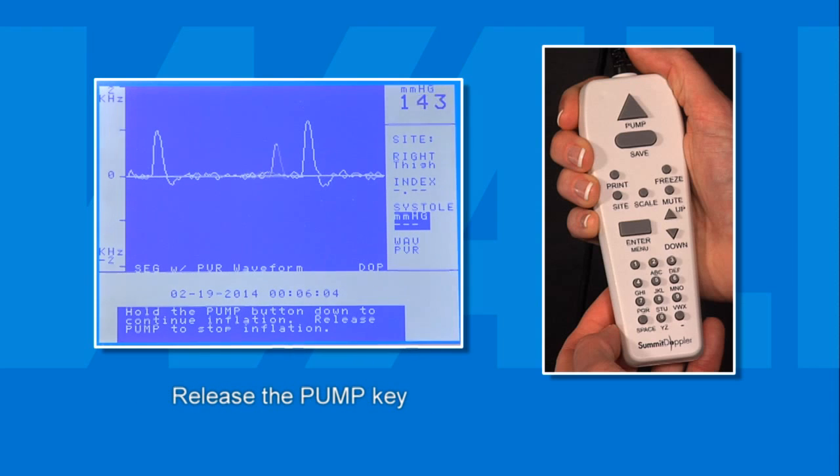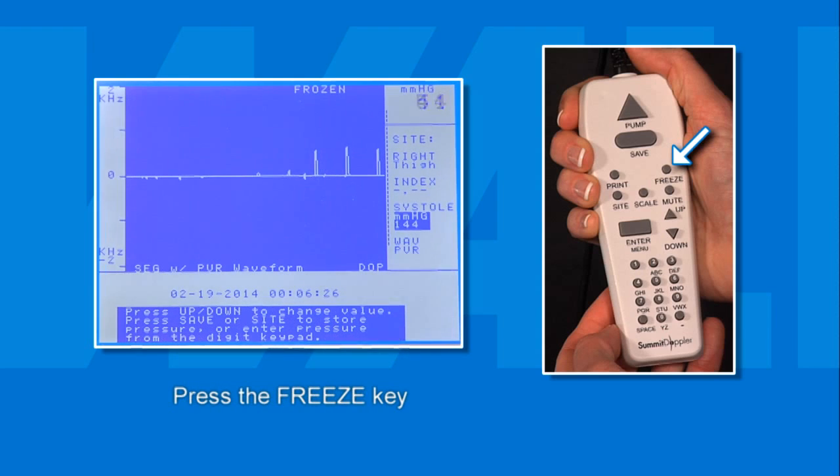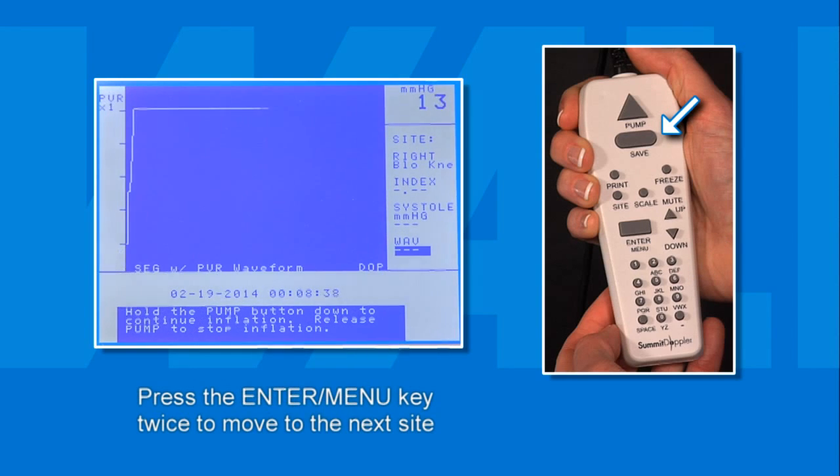Once this occurs, release the pump key and the cuff will automatically begin to deflate. When the pulse returns and the arterial blood flow becomes audible again, press the freeze key on the keypad to freeze the image on the graphic waveform display. When you have determined the pressure is correct, press the save key. If the pressure needs adjusting, use the up or down keys to move the caliper to the exact spot where pressure returned, or enter the desired number from the keypad. With the pressure recorded correctly, press save and then press the Enter menu key twice to proceed to the next site.